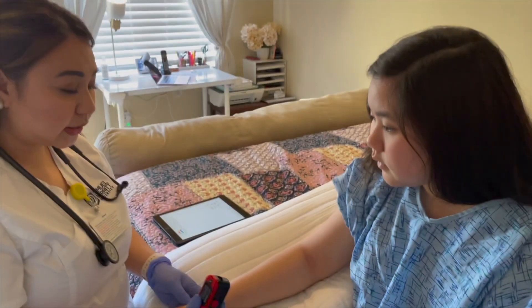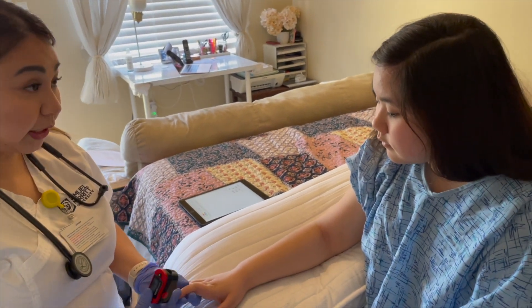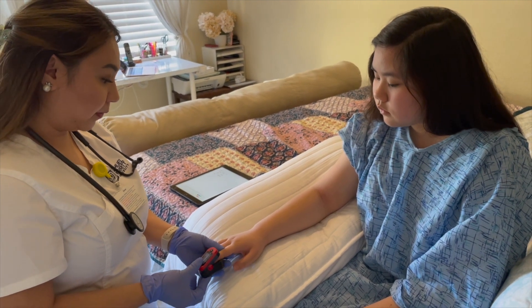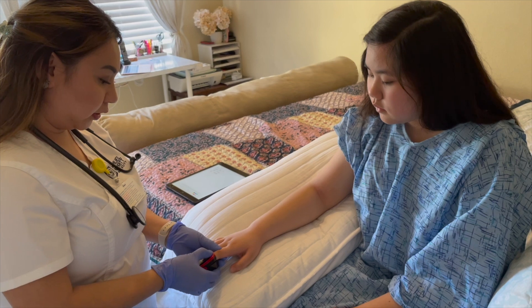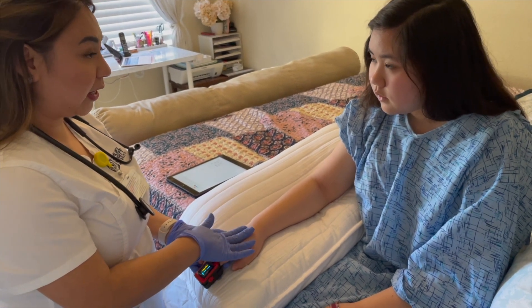Sarah, this is a pulse oximeter — I'm going to place it right here on your forefinger so that it gives me the figures for your oxygen saturation. It shouldn't hurt. Let's just keep that there.